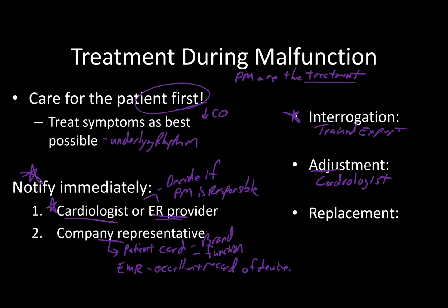Last but not least, and of course the least ideal scenario, is replacement if needed. If you run into one of those big problems where it's truly broken, either the generator or maybe a lead came loose, things of that nature that require a procedure, don't be surprised if something like that happens. But again, last resort, hopefully it never comes to that.